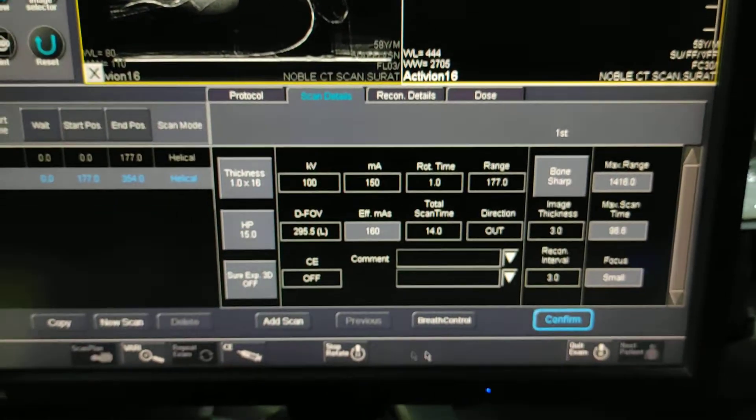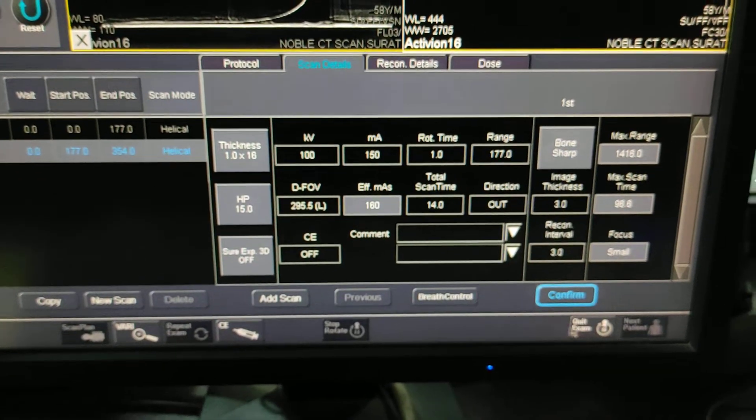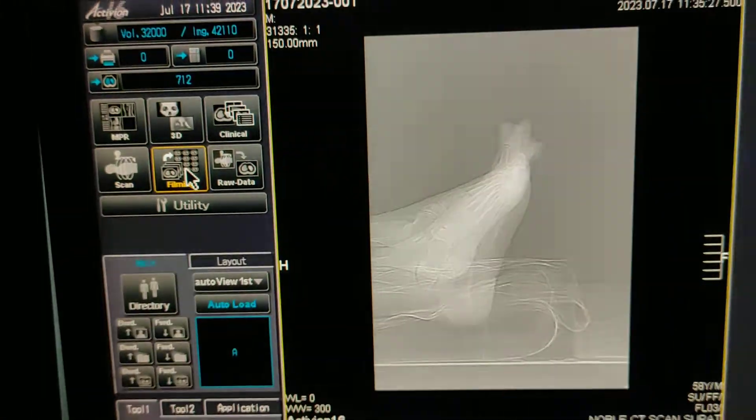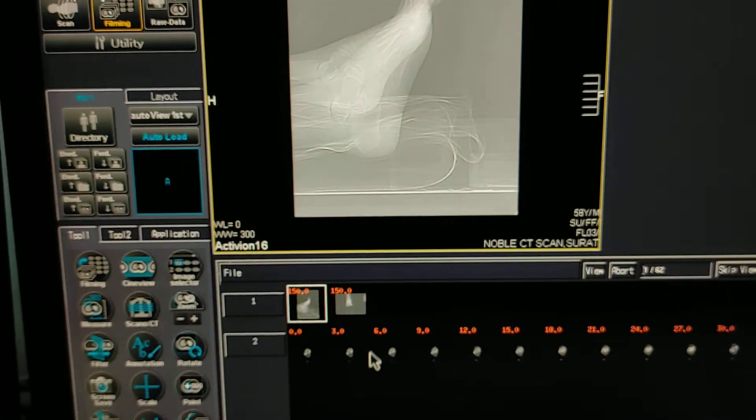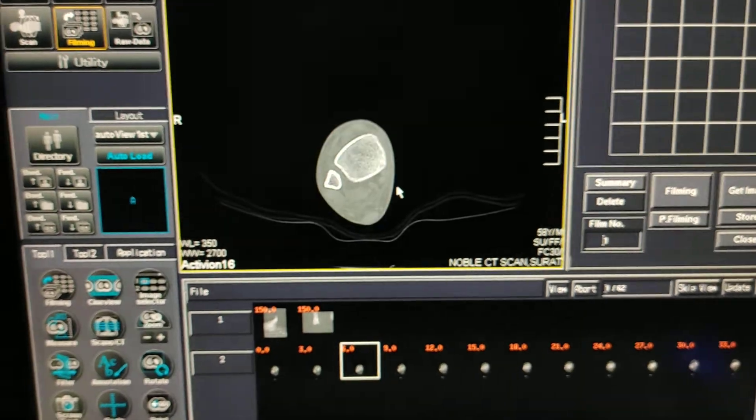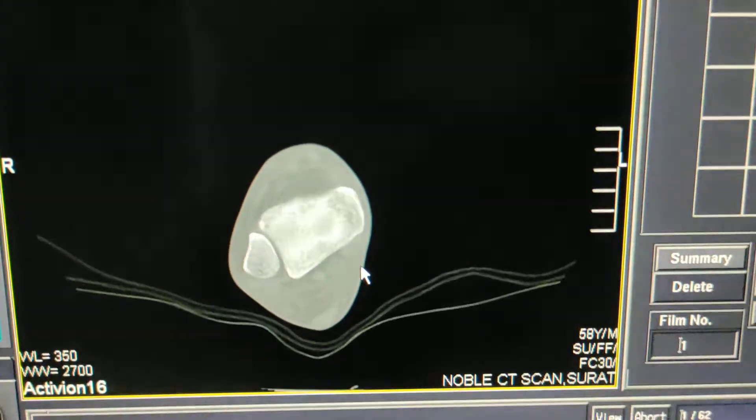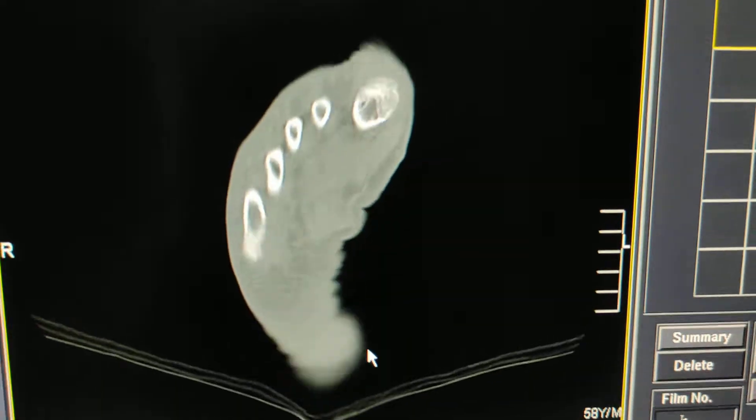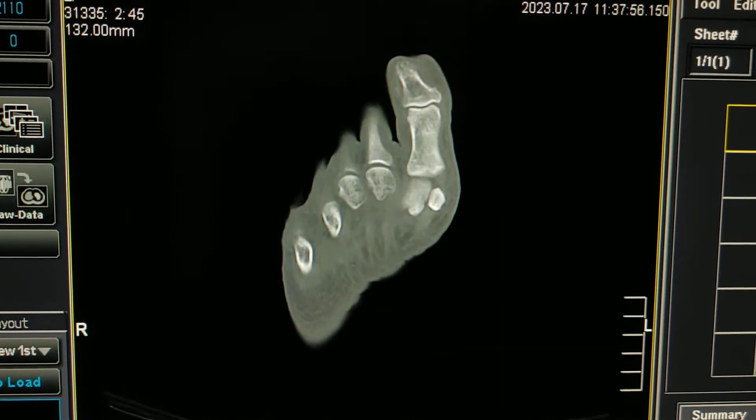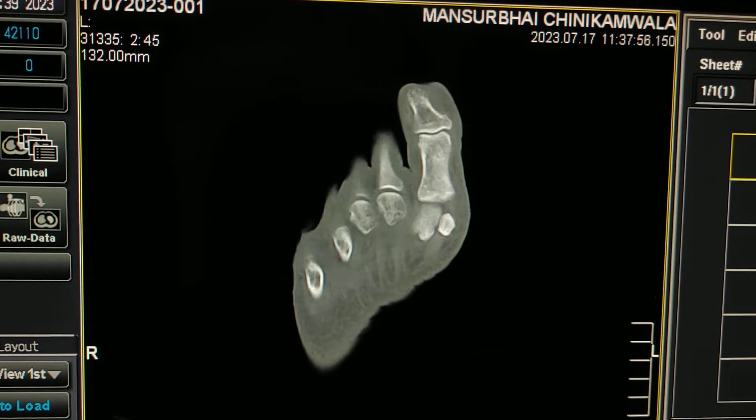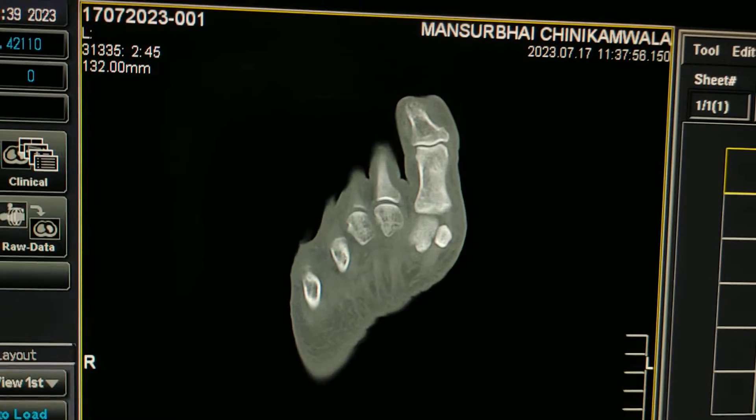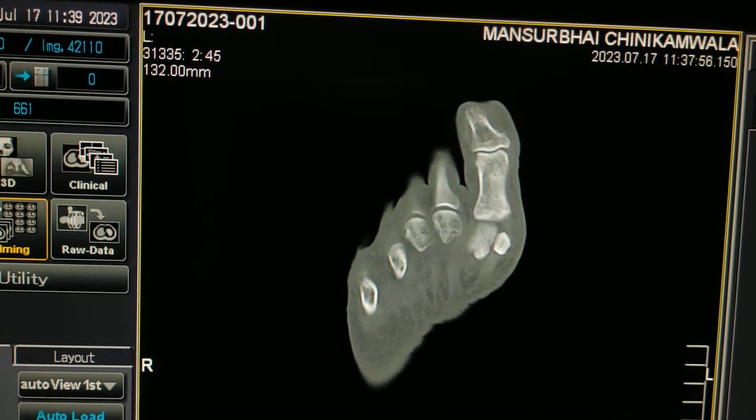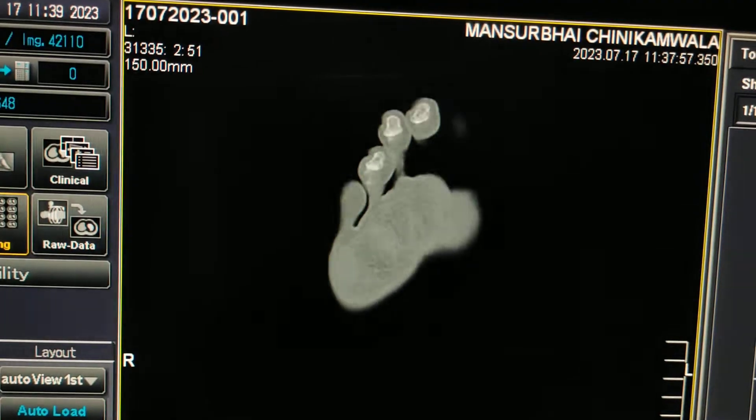Now stop rotation, quit exam. Now we will go in filming to check the data. Your patient is having infective purulent discharge.